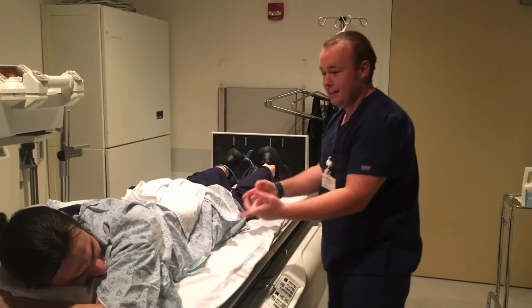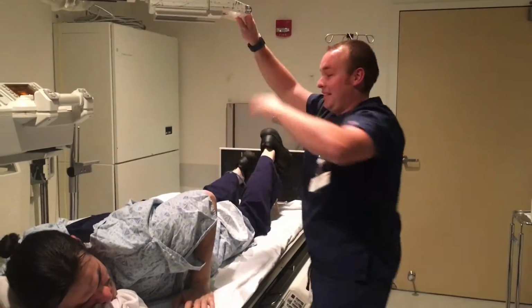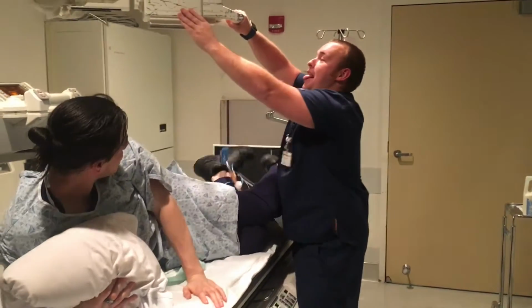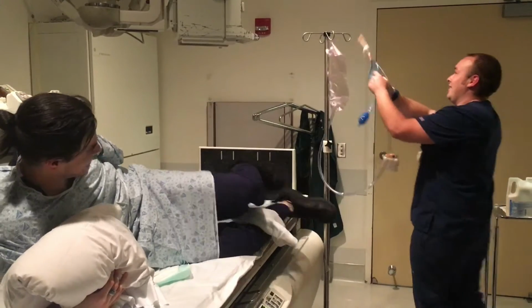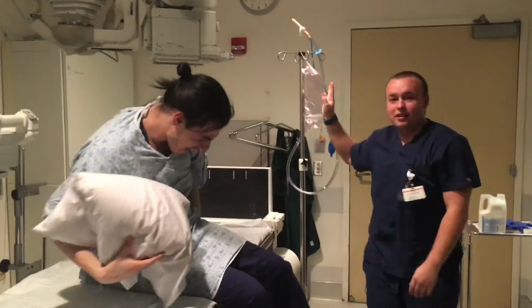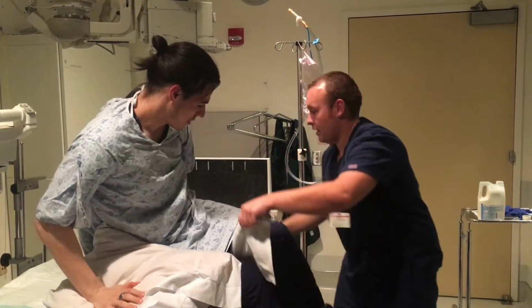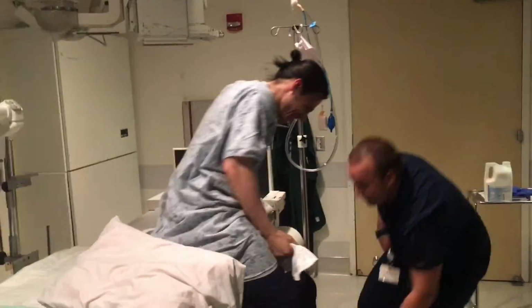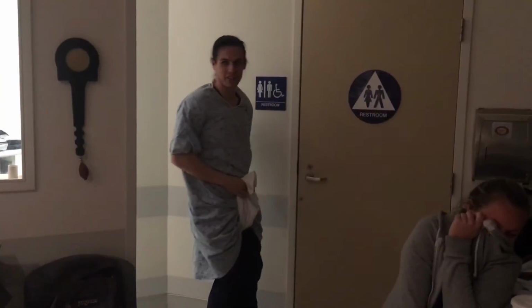Go ahead and, can I get you up off the table? Watch your head there. Oh, God. Mess. Want to watch out for that because there could be barium dripping. Yep, just like that. And then here's the little stool. Yeah. You're good, right? Bathroom's right over there. Try not to make a mess and come out when you're done.